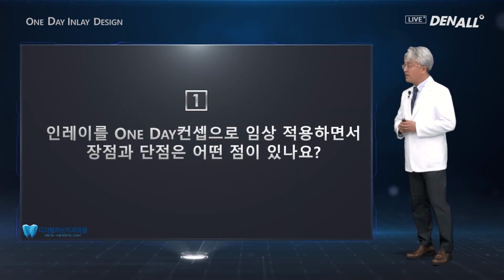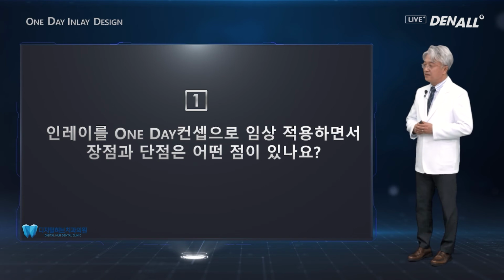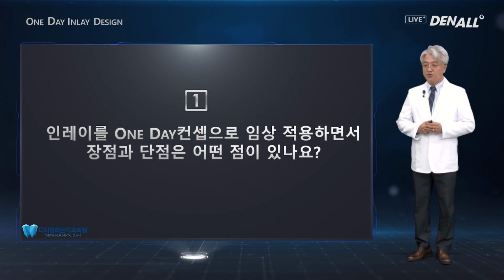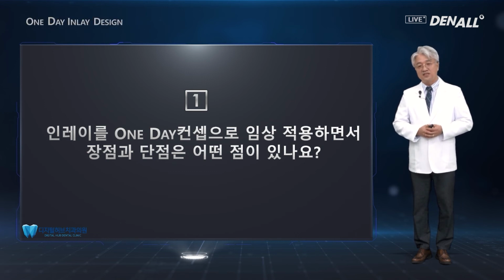First question, if you do clinically one-day concept for inlay, what are the advantages and disadvantages? I think there are much more advantages than disadvantages in the one-day inlay concept. The biggest advantage is that everything can be finished within a day with one visit if everything can be completed. Then for the patient and also for the clinician, time-wise and also financially, it's very attractive.